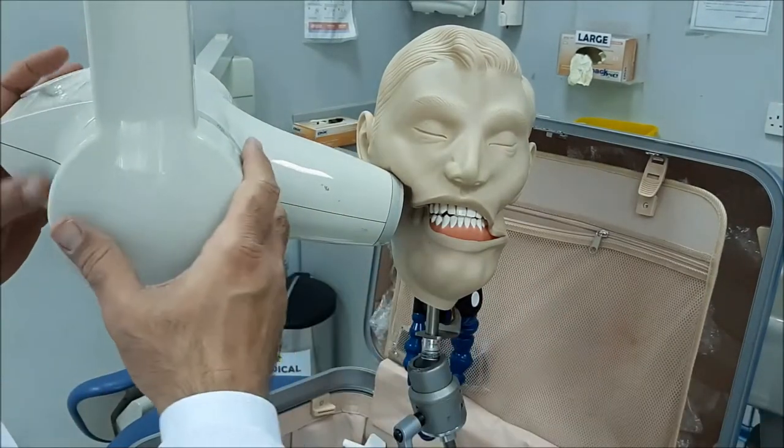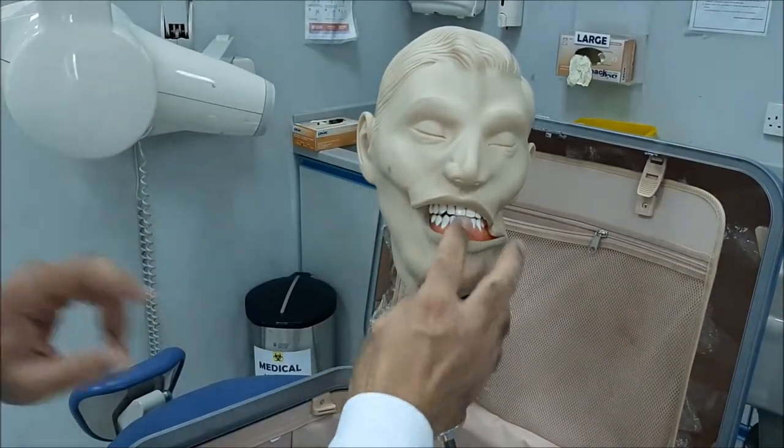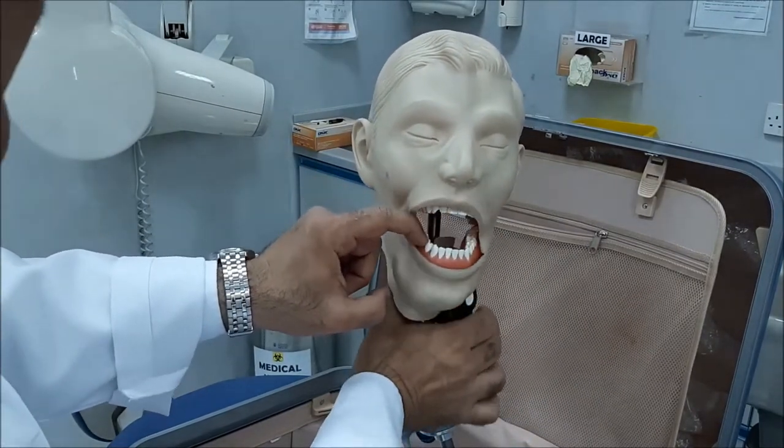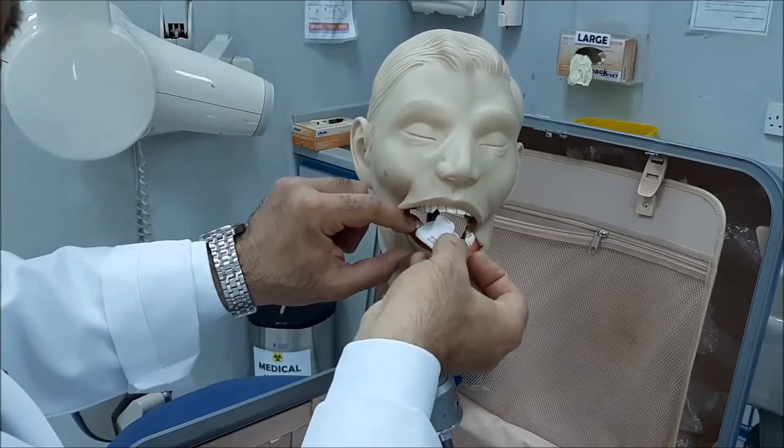Once you do your exposure, you reverse, ask your patient to open, and then remove the film out of the oral cavity.